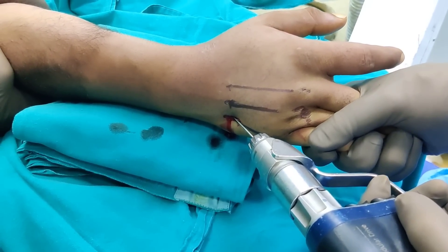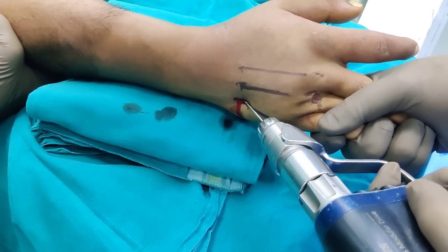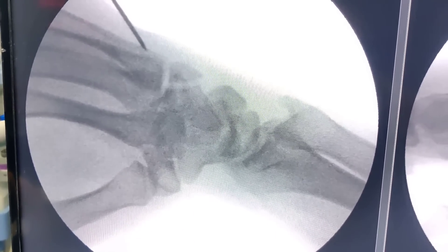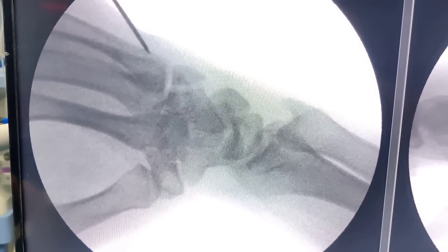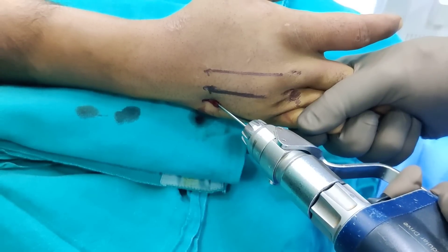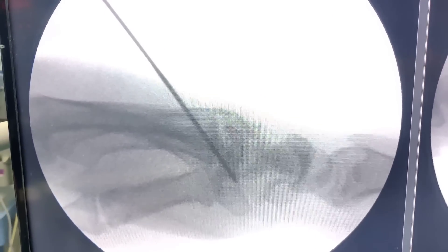While passing the wire, remember the lines you have drawn — your wire should go in the same direction. Also take a lateral image to ensure you are not too distal or too proximal. If you see our entry point on the lateral, it is roughly a centimeter to a centimeter and a half proximal to the carpometacarpal joint, which I think is perfect. I am happy with the direction; I am now passing the wire. You will get a feel that it is in the bone. I will check it on the C-arm — we have passed our first wire and the joint looks pretty reduced.